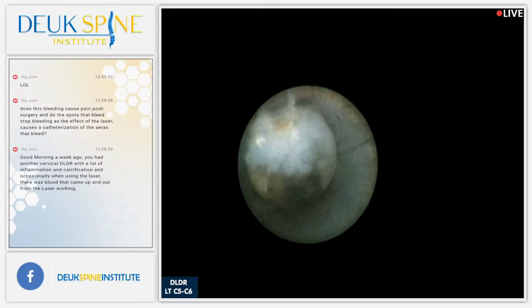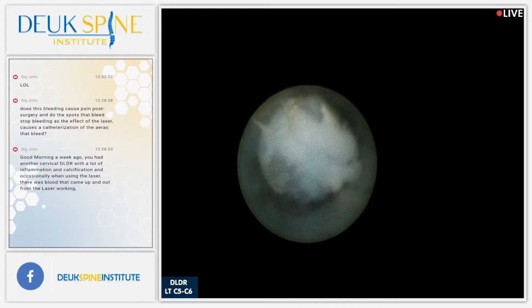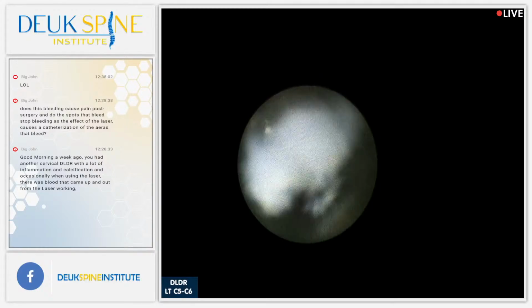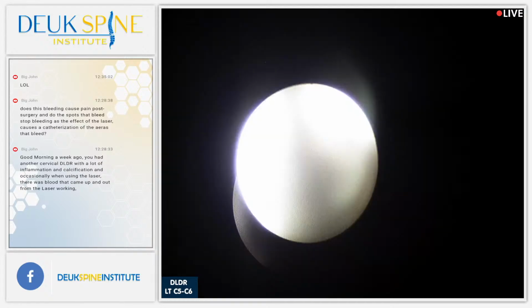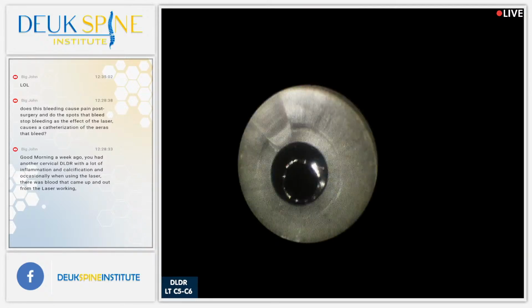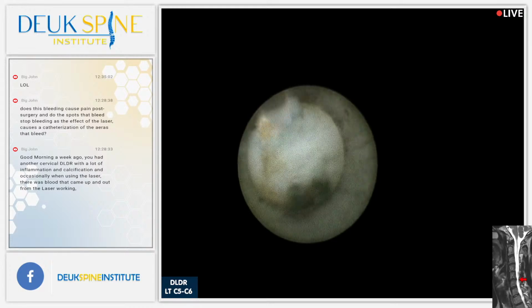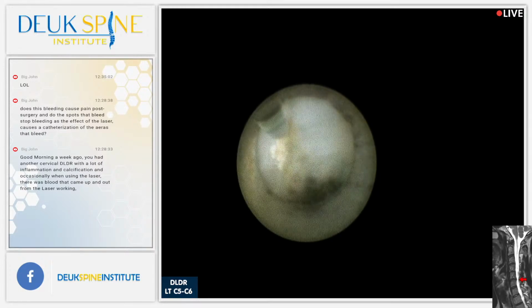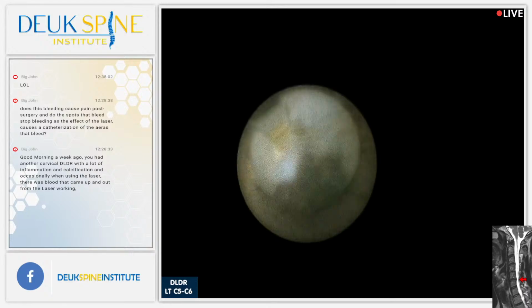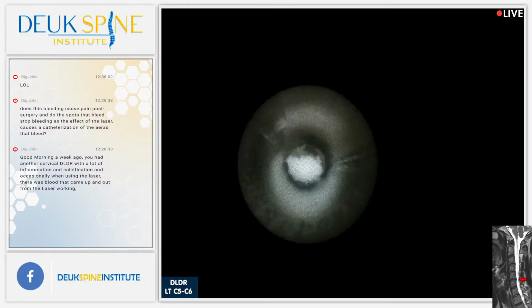All right, this is a lot bigger herniation than I could tell on the MRI. Look at this. So many pieces. Again, could not tell that based on the MRI. Take a look at the bottom of your screen. There should be an MRI down there. And it doesn't look that bad. Like most of the time, doctors would just blow that MRI off. It's not bad. You probably have something else causing your pain, but look at all these chunks of herniation. Another one.